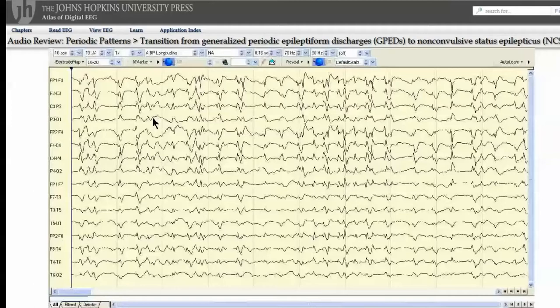This EEG segment shows synchronous activity bilaterally. In this array, where you have left from front to back, anteroposterior over right, and we are showing parasagittal derivations overlying temporal derivations, you can see clusters of sharply contoured morphologies. These wax and wane and appear anywhere between approximately 2 per second to frequencies in the region of 8 to 10 per second. It looks a little bit like an accordion going in and out, with concentration of spikes seen synchronously bilaterally here, and here a relative lower frequency appearance of these spikes for about 1 second.